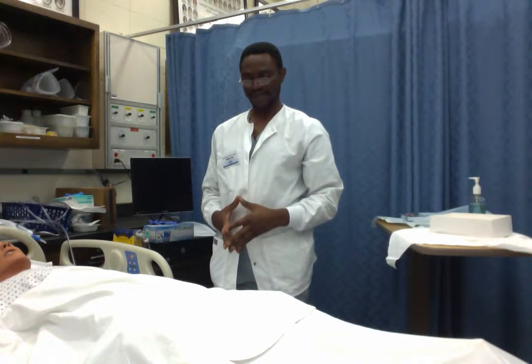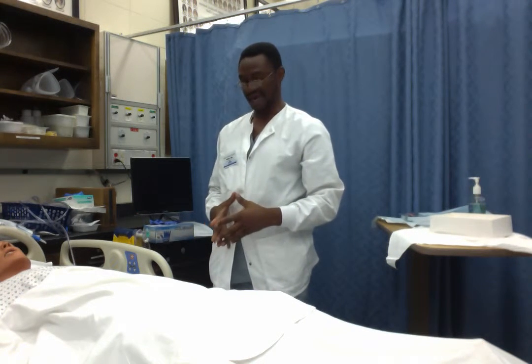At this point, I will document that the catheter was inserted aseptically. I'll document my initials and the time at which it was done. I will also document any abnormal findings which I could have come across. And that will be the end of the procedure.